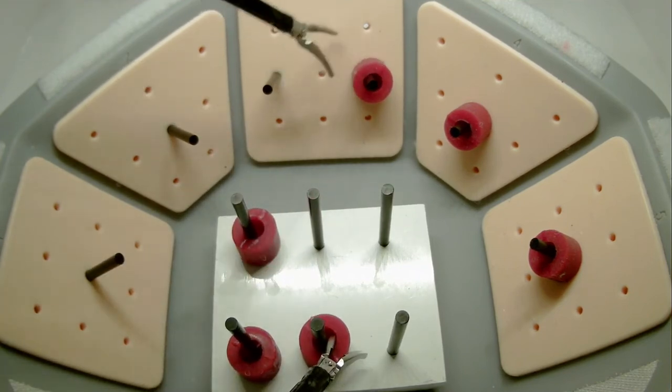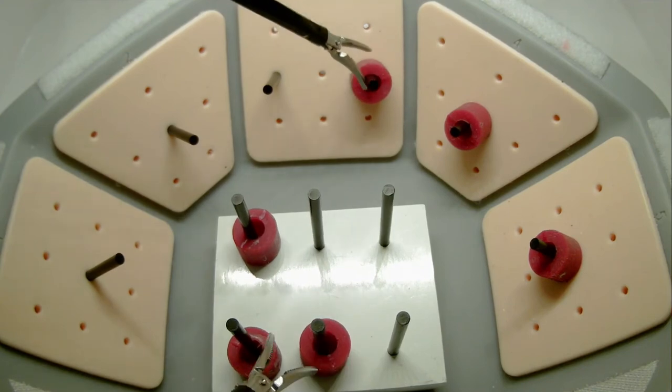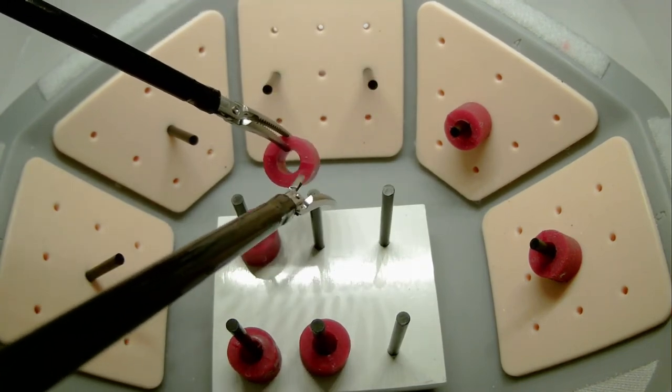Should you drop a sleeve, you are required to retrieve it with the hand that you dropped it with and then perform your transfer. You cannot use a drop as your transfer point.